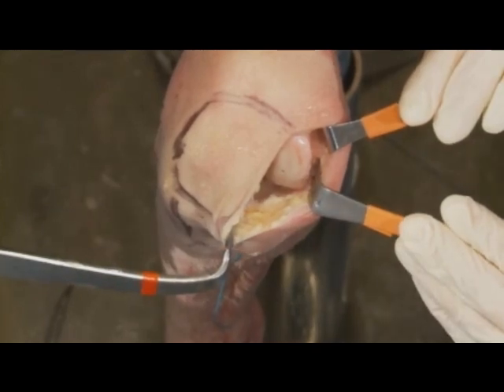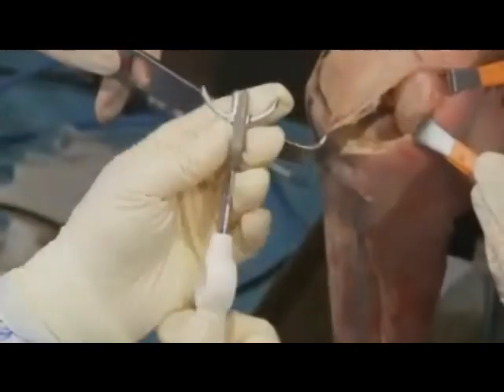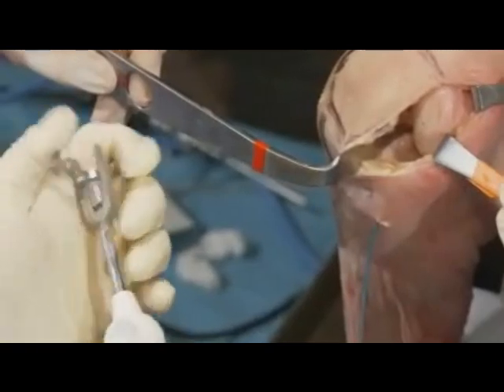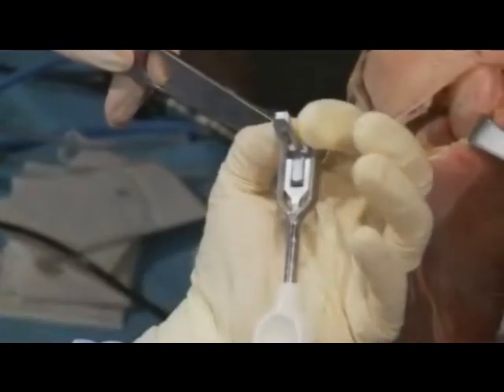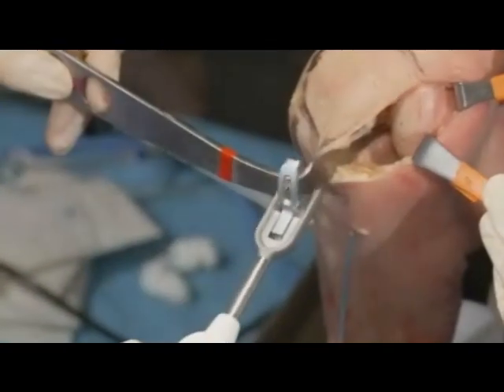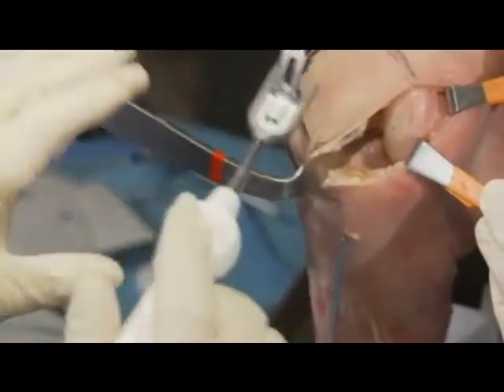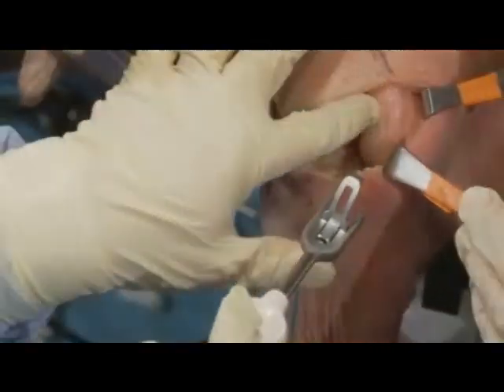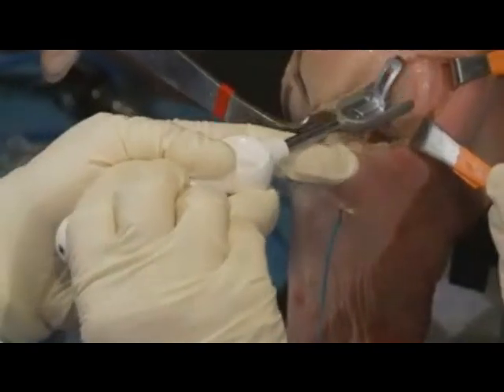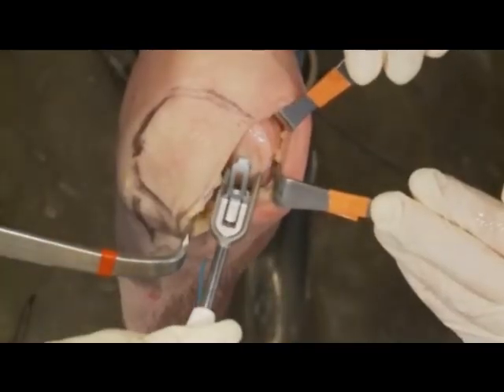And what we have here, this instrument here, if you see the device, it has two free arms. There's an AP and a medial lateral direction. And what they do is by touching all of these to the femoral condyle, you see they move independently? So what it allows is for you to get perpendicular both in the AP and in the medial lateral plane. So you want to actually put this implant right on the axis of rotation of the cam of the medial femoral condyle, so you got to make sure it's not perpendicular to the leg. You want to make sure that it actually follows the contour of the joint surface, and you want all 4 points to be touching.